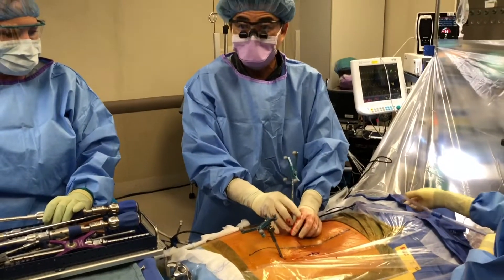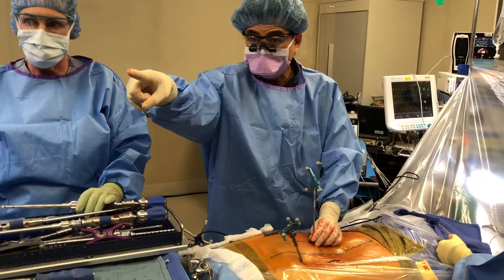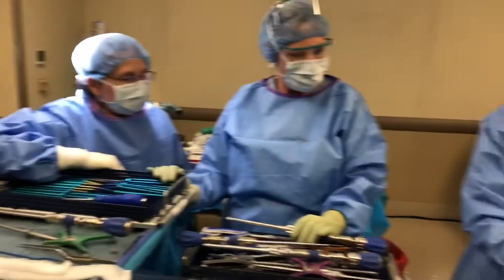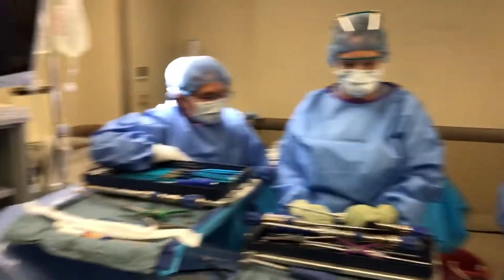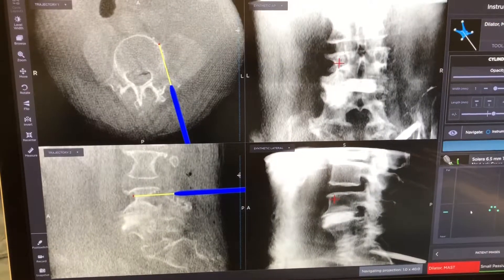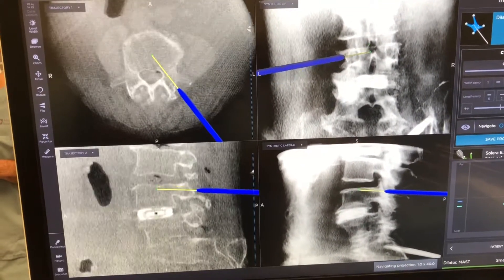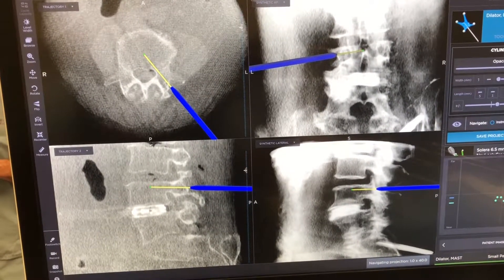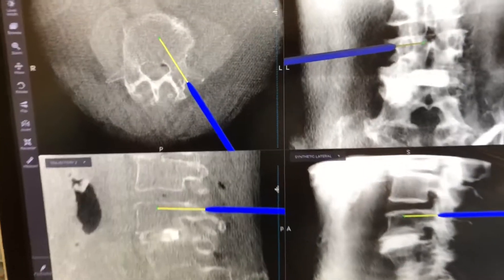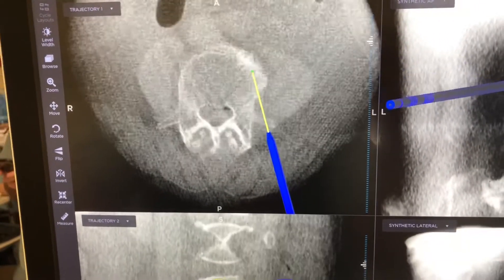I want to basically visualize a bony anatomic structure that I know, or feel around and confirm that everything I feel is exactly what I would expect. If there's anything off, I'll stop. The first thing I do is find the transverse process and feel it. If what I feel as I walk around is not exactly what's on the navigation system, I know there's a problem. Right now it's behaving perfectly — I can walk up the lateral aspect of the superior process, get down to the sulcus, walk out laterally, and feel myself fall off inferiorly and superiorly.